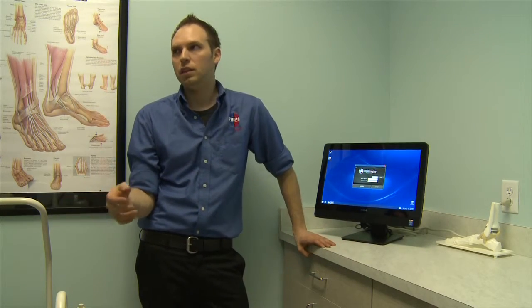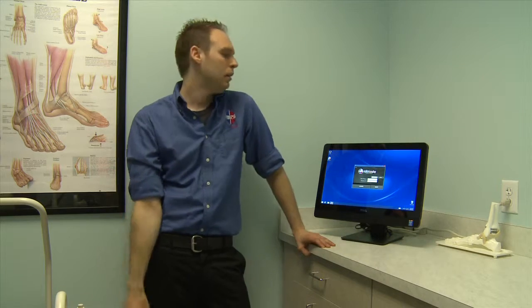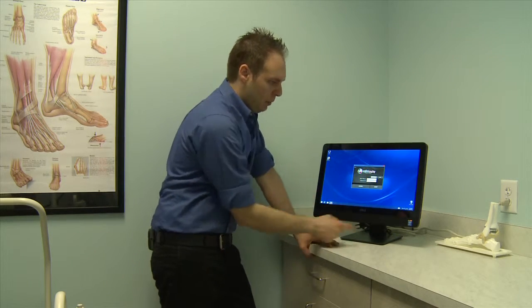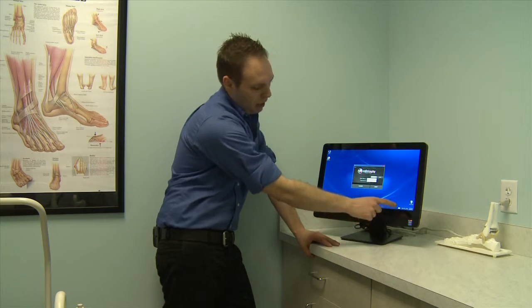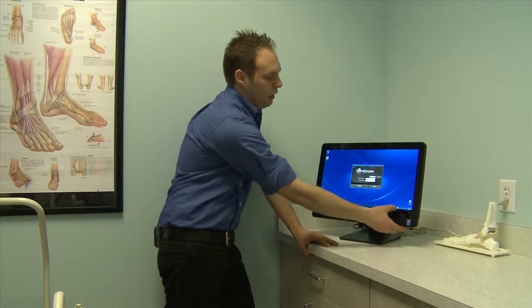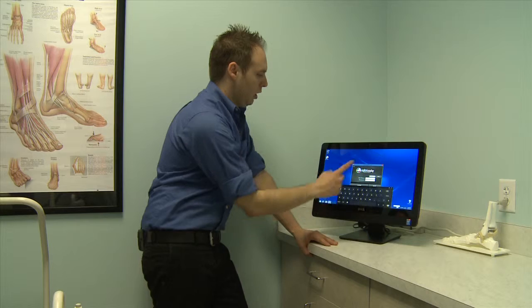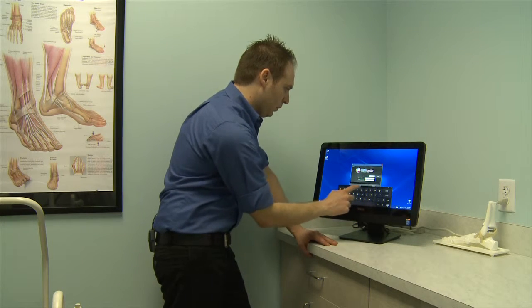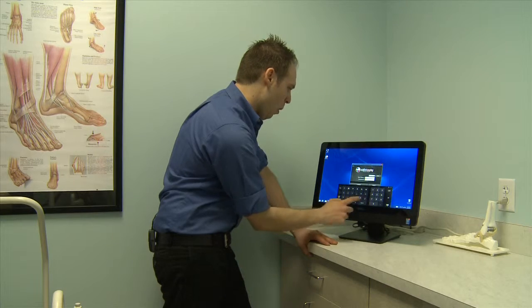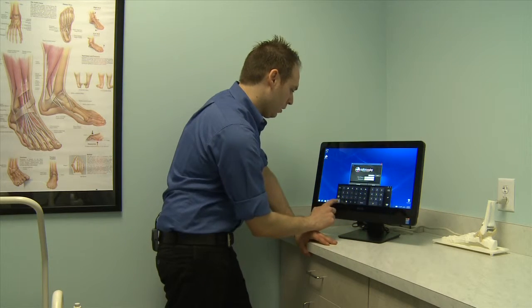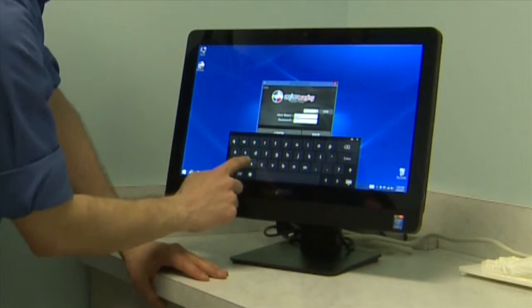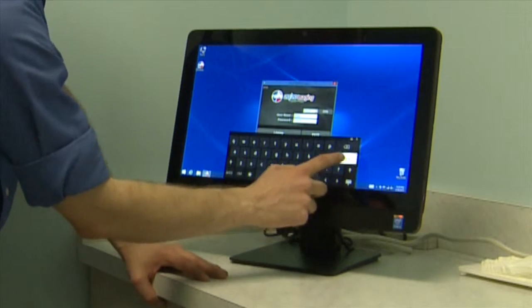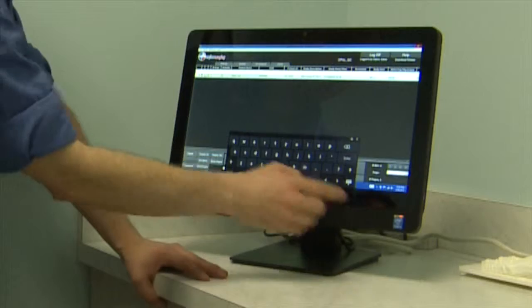Different permissions give you the ability to delete studies and things like that. Simply click where you want to type, and in the bottom right-hand corner there's a little picture of a keyboard. Hit that for your touch screen and the keyboard will come up. Type admin and then your password, 2020 Tech. To get rid of the keyboard, hit the button again.